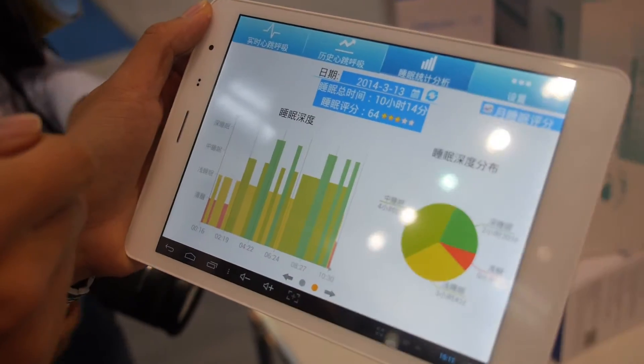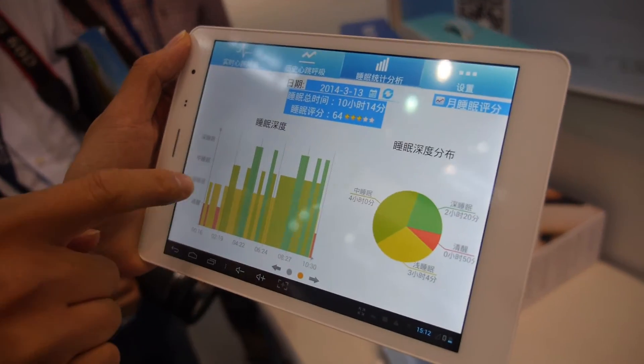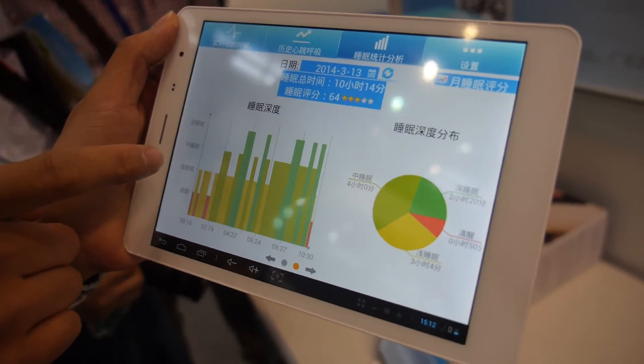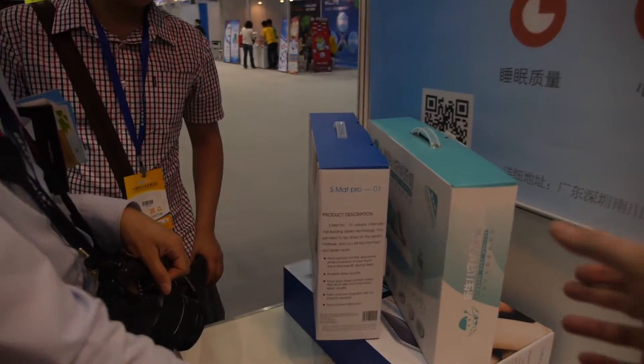This shows the sleep quality — it shows you the sleep pattern during the night, at what time you were in deep sleep, and at what time you were awake.